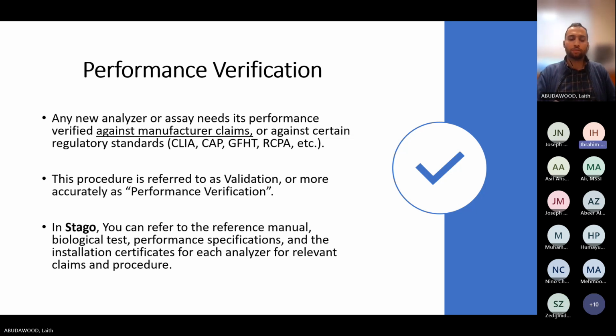Yeah, I think one very important point was missed here when we were discussing lab mean and lab SD. This lab mean and lab SD should be done while we have a current lot that is already running. So the current QC lot we would be doing. While we are doing that, we will do the new lot's mean and SD, because otherwise, how would we know our QC is actually in control while we are establishing the new mean and SD for the new lot?